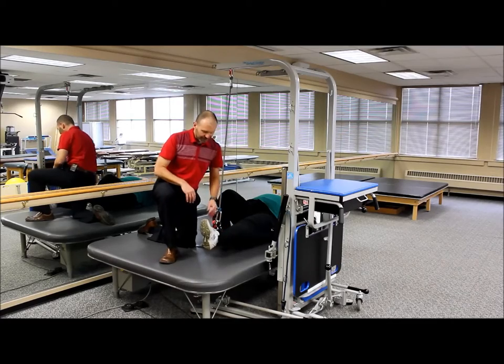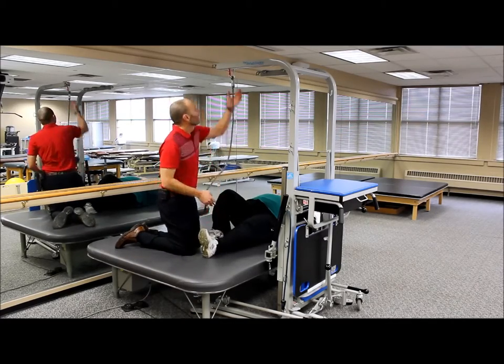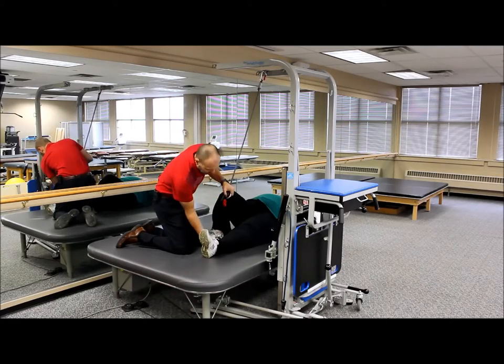Another thing we can do — just changing angles here a little bit — is we're going to go ahead and unclip and place this back on the other support structure so we've got a little more of an angle this way. And we're going to go ahead and attach the limb here.